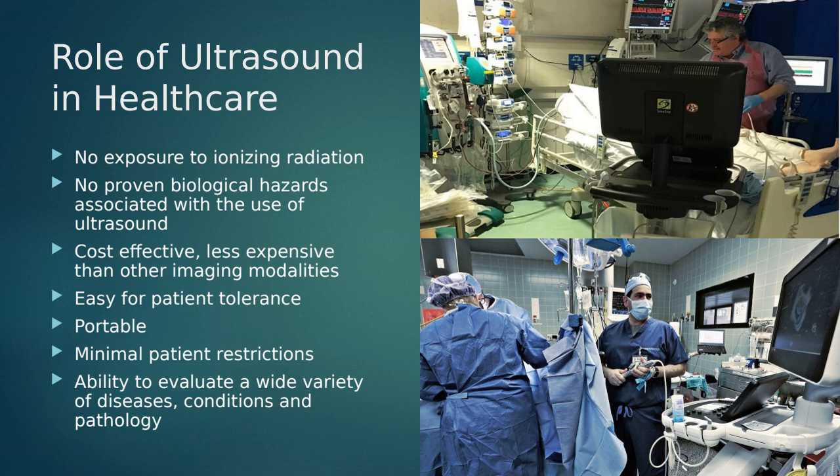It is a fast, easy to tolerate procedure for our patients. It is highly accurate. We have a 2 millimeter margin of error, which is just phenomenal, meaning anything smaller than 2 millimeters, so in that 1 millimeter range, is where we lose some of our detail. So think about how small a millimeter is. We're seeing everything that can be bigger than that.